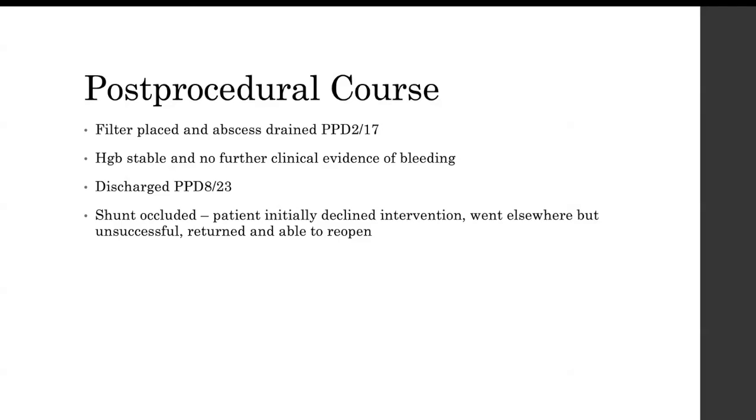He had a whole long saga where we went to another hospital where they tried for 7 hours and couldn't do it. Couldn't reopen it. I ended up reopening it by essentially repeating this process. I passed the needle down through his abdomen, through the stent into his IVC, and then just relined the stent and got it open. And again, his hemoglobin was hovering right around 7. Now it's usually in the 9 or 10 range. He's never going to be normal, but he's holding steady in a higher range and feels better.